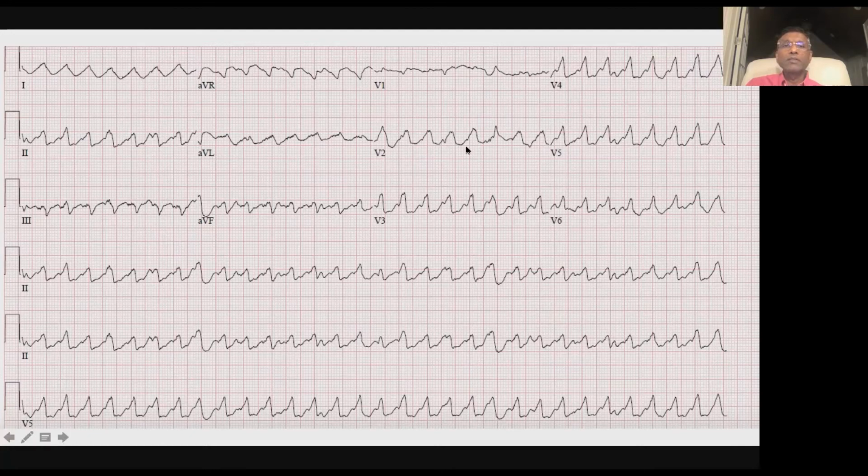You think typical or atypical for a left bundle? Does it look more like a normal left bundle branch block complex, or just not those usual criteria? Which doesn't look normal, sir. Doesn't look normal. Good. So you imprint in your mind a typical left bundle, and this tracing will be no problem at all for you.